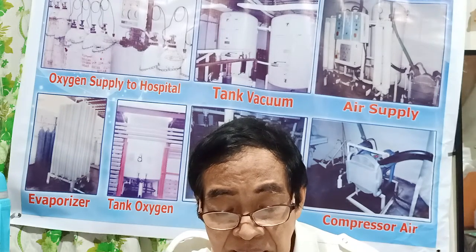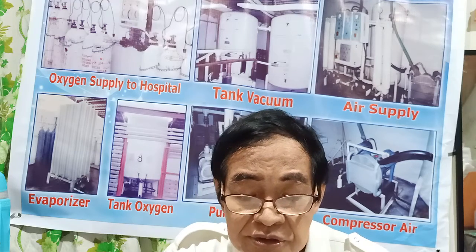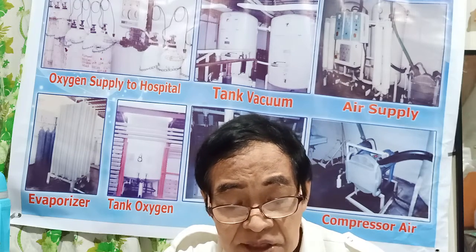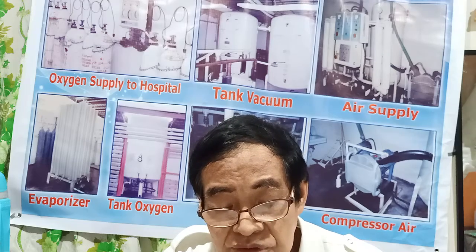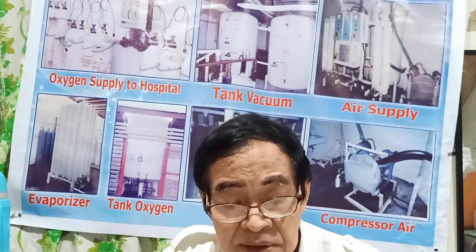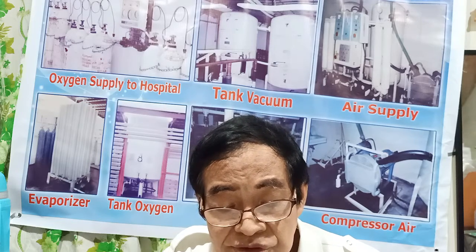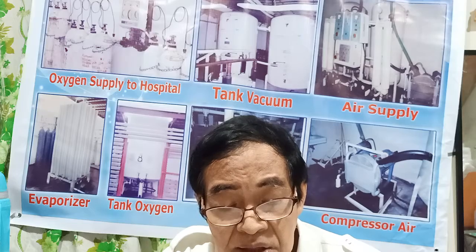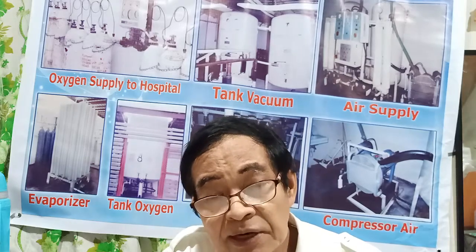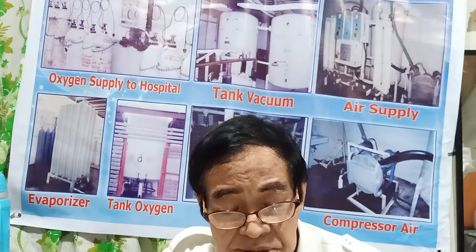The bursting pipe can cause serious injury to the personnel and damage to equipment in the vicinity of the installation. Very dangerous to connection of the pipe. Be careful. You have a preventive, the rules of the maintenance.